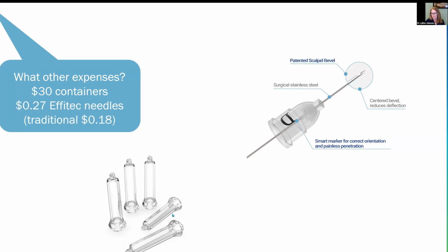And the important thing to do is make sure your team does not throw them away. They look rather disposable and they should be autoclaved. How do I know? Because our team, in the process of a double doctor day, we have 6 devices, threw away more than $1,000 worth of containers. So make sure that doesn't happen to you. And of course, I didn't realize it until the garbage went out. The garbage people came and we didn't have any containers. And Jordan had to emergency send containers to me.